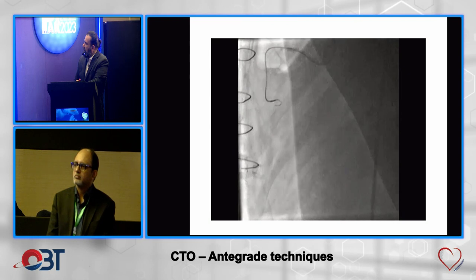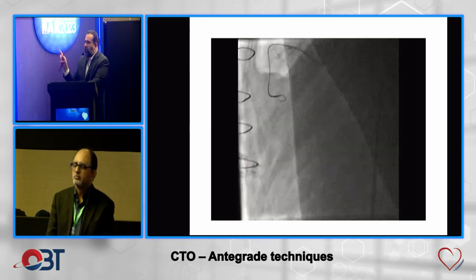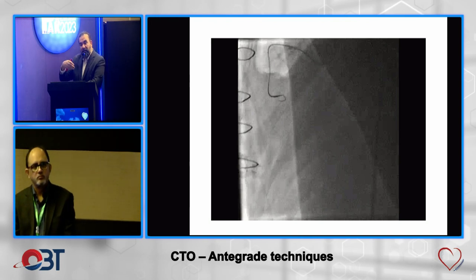Then I took a Gaia Second. Sorry? Then the third wire was Gaia Second. So this is not the Gaia Second though. Yes, this is Gaia Second. Okay. Again, it's such a wide thing. So yeah, two things only. Either he's curling up against the proximal cap, or he's going to a side branch with the Gaia Second, right?